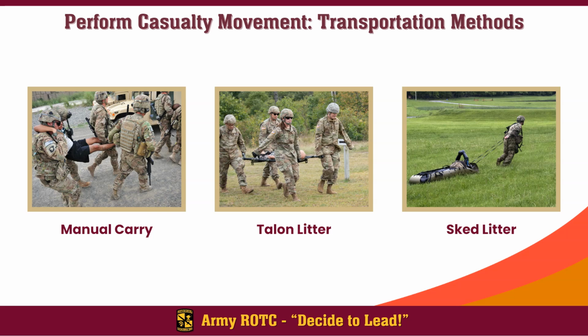Now there's 3 different transportations that we'll talk about in this lesson. We've got the manual carry, which is self-explanatory, right? They are moved by personnel from one spot to another. Then we've got the talon litter, and I'm sure you've seen this litter before. It's the pole litter that folds out. Very easy for medical personnel to carry and move a casualty with.